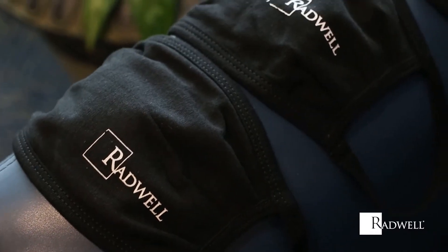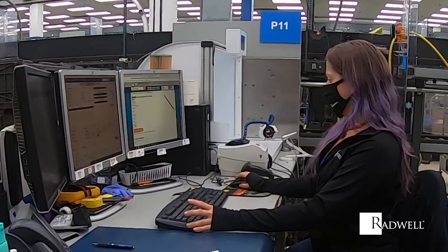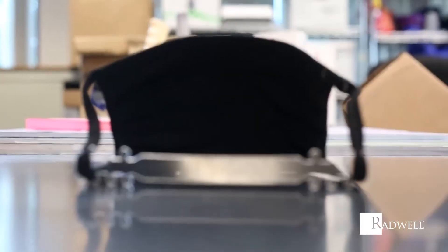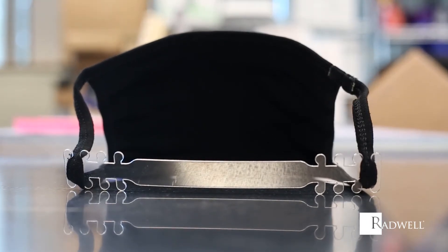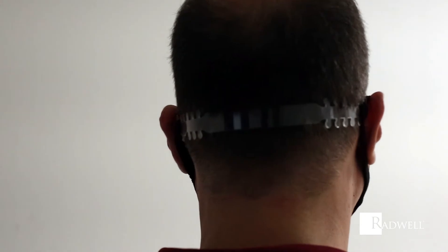If you are looking for a lightweight 3-ply face mask to keep you and others around you safe, then this mask is the perfect solution. And don't forget to add your ear savers to your mask order. Ear savers are a great addition to make masks even more comfortable.